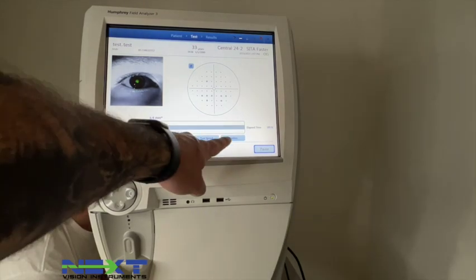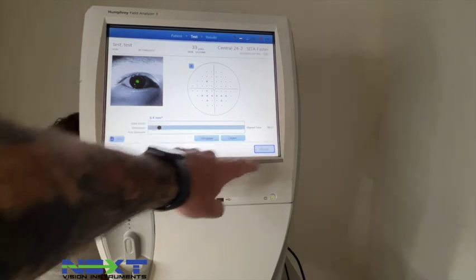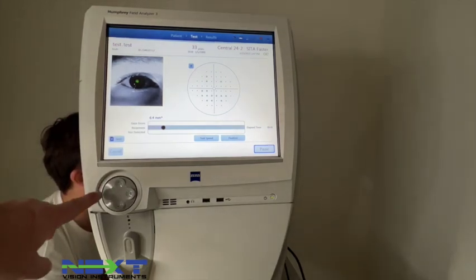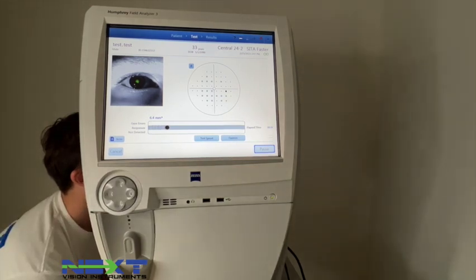The progress bar shows how much time has been running. You can pause the test from this screen and adjust the test speed. It also shows you what points have been checked so far and provides a live feed of the eye. If the patient is moving around you can readjust, but make sure their chin is down and forehead is all the way against the forehead pad at all times for the most accurate results.